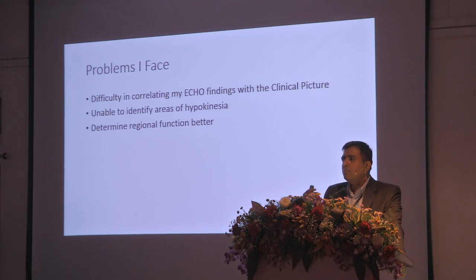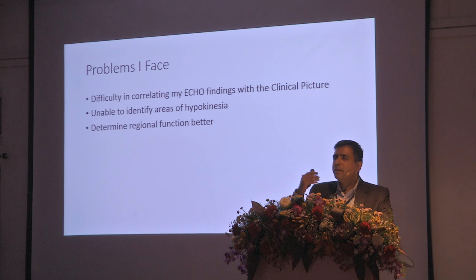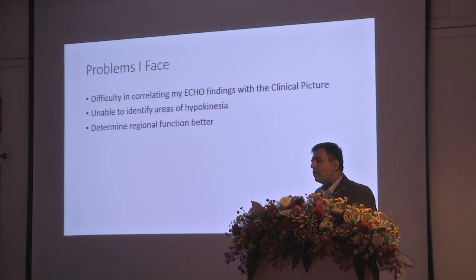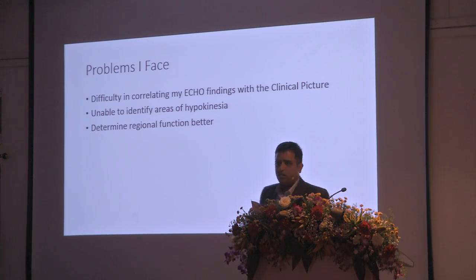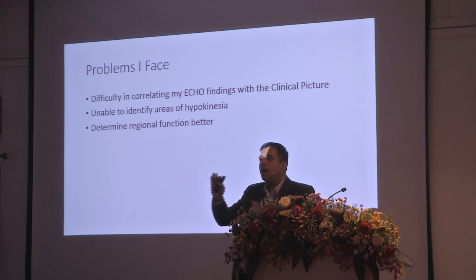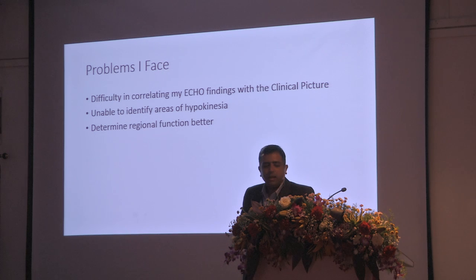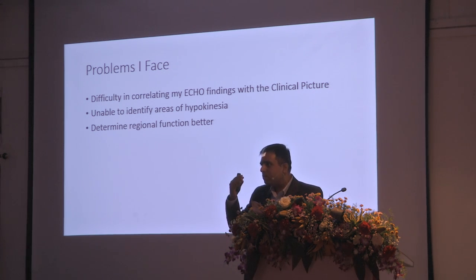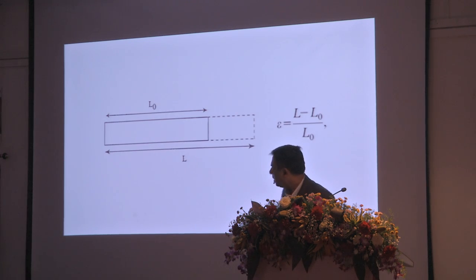These problems are overcome by the use of new tools such as strain and strain rate. And as I said, this is going to be the future, and don't let anybody tell you that you can't do it. Don't let anybody tell you that this is too hard for me. It isn't. And I hope over the next half an hour that I will be able to demonstrate to you that yes, this is something that I can do.